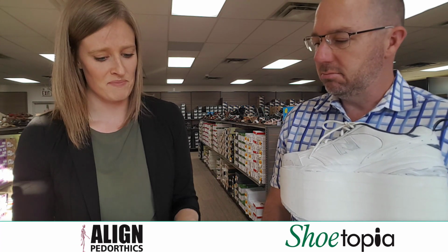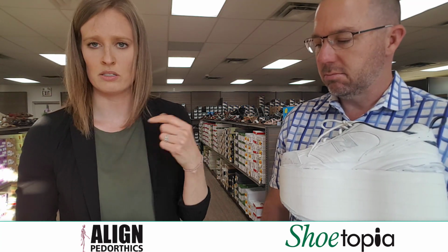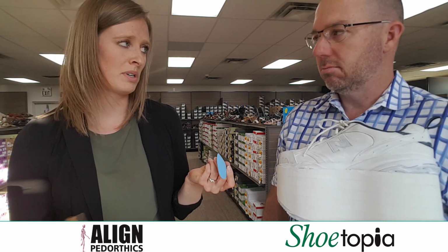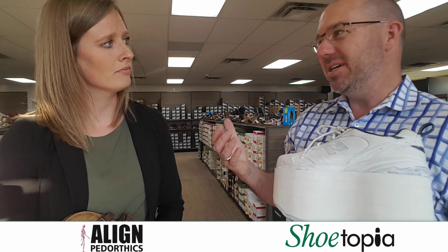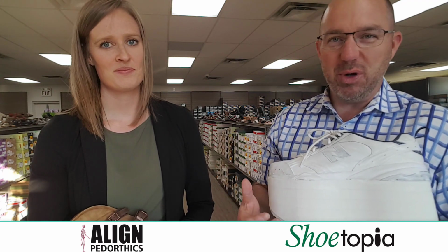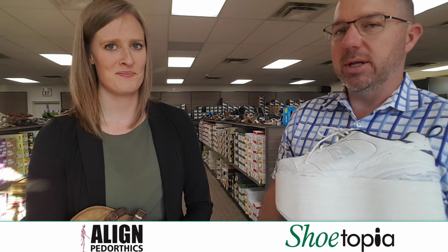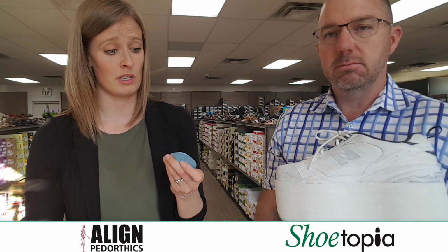Yeah, that's good. Another thing is adding in maybe a metatarsal pad. Same thing if you're having any sort of forefoot pain. If you have a met pad on your orthotics and you're used to that, I can add that into a sandal. That can also be added into footwear as well. We do get that a fair bit for people that have been wearing their orthotic in their shoe or boot all winter long, especially in the spring, and then they come back into the sandal and say, oh, I'm not feeling the met. That's even more than the arch. We hear about the met. So that's a big one, and you can add those in as well.